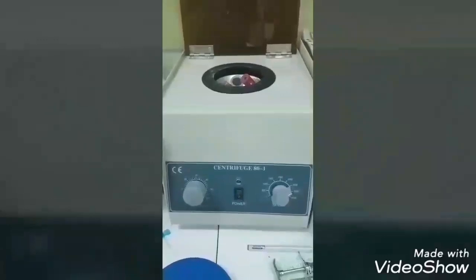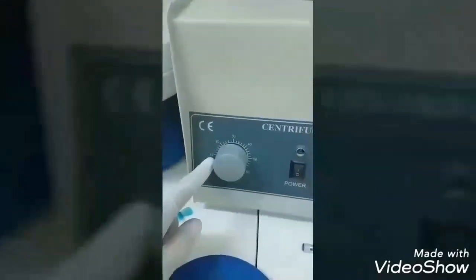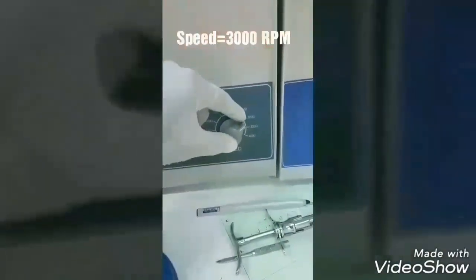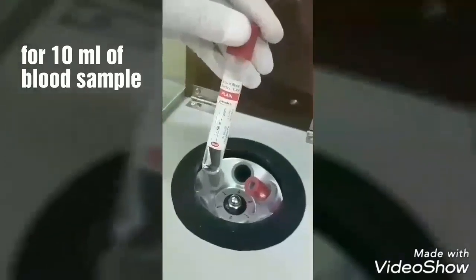After that, insert the blood collected in the glass tube into the centrifuge device. Set the time at 10 minutes and set the speed at 3000.